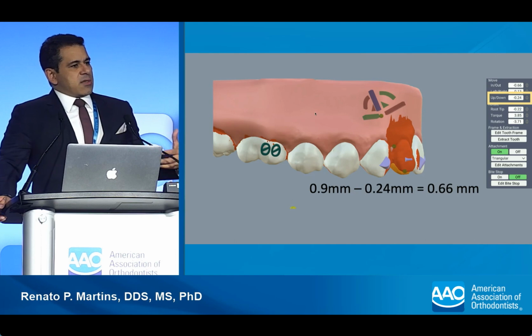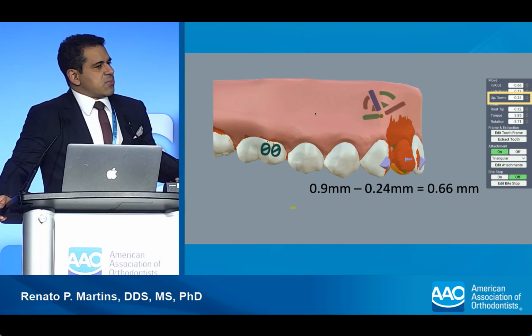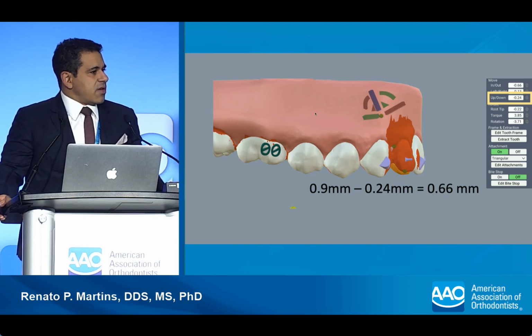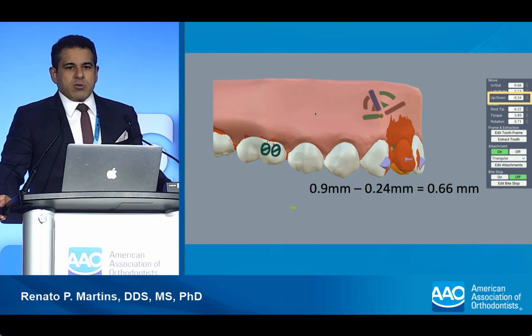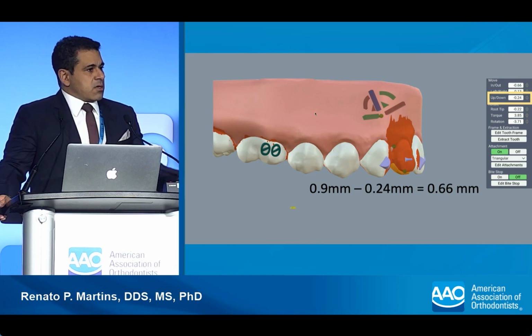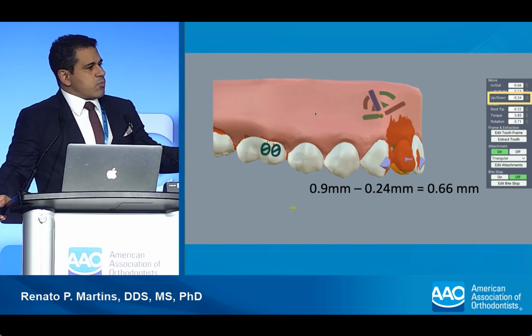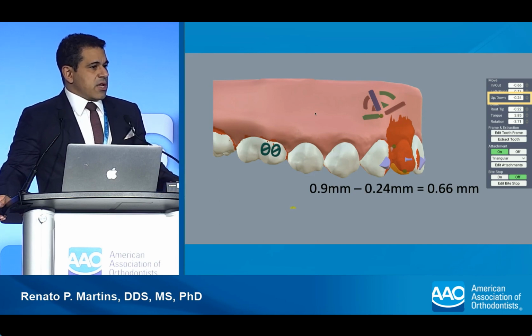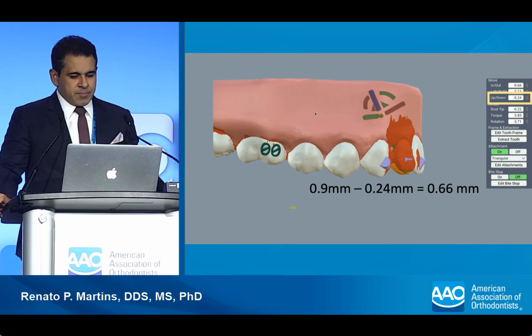And this is a healthy criticism that I have to make to the research that we are having today that measures vertical with aligners. They put everything in the same bag, which is the extrusion which is pure and the extrusion which is relative to the incisal edge. And we cannot put them in the same bag. We need to measure them separately.